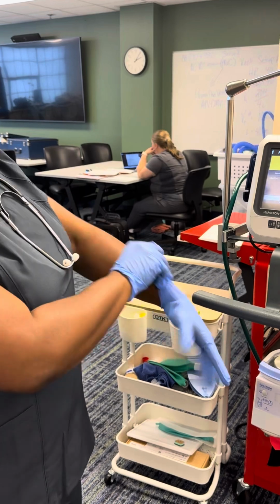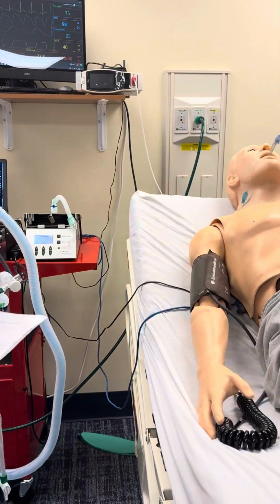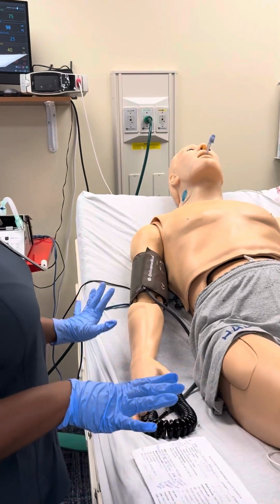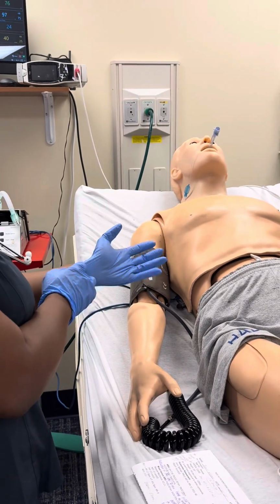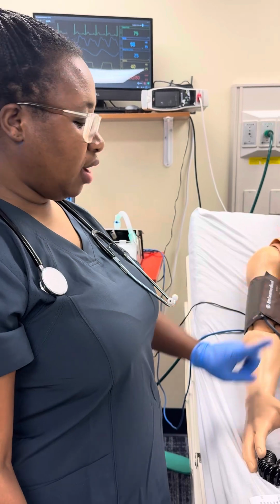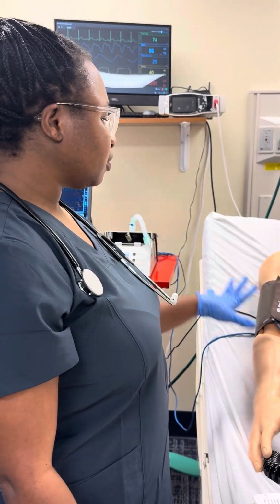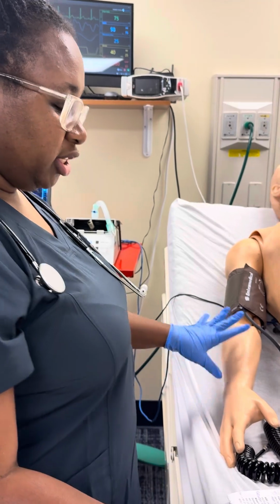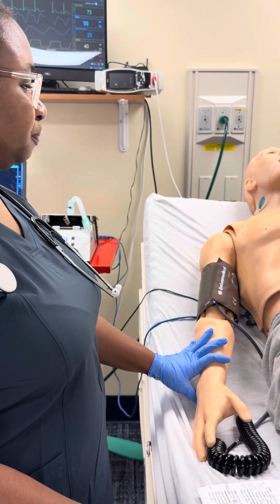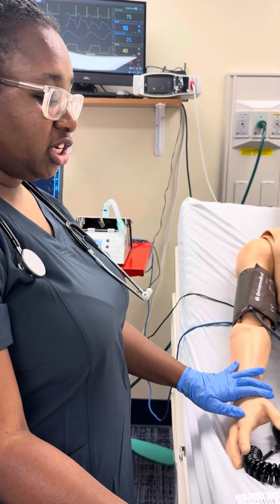Okay, I'm going to knock on the door. Hi, Miss Haley. My name is Terry with Respiratory. Can you identify your name and date of birth for me? Patient is unable to do that, so I will check the bracelet to make sure it matches all the data in the computer. Okay, I'm going to explain the procedure, which, indication would be to maintain ventilation and oxygenation.